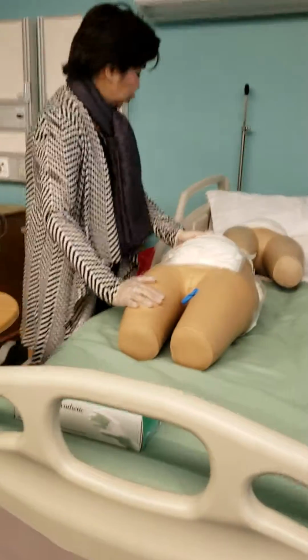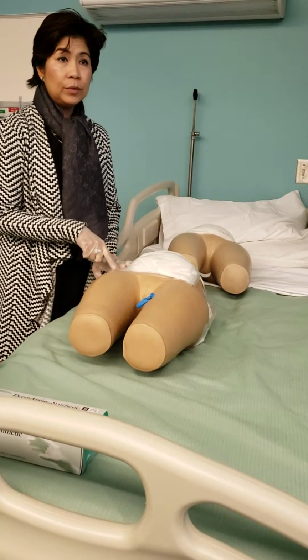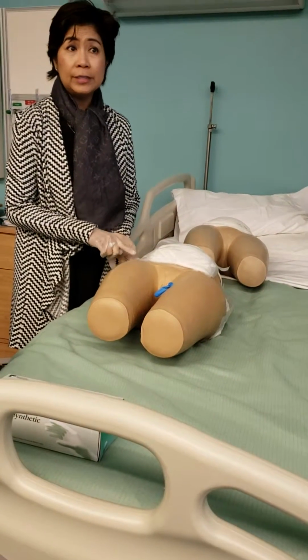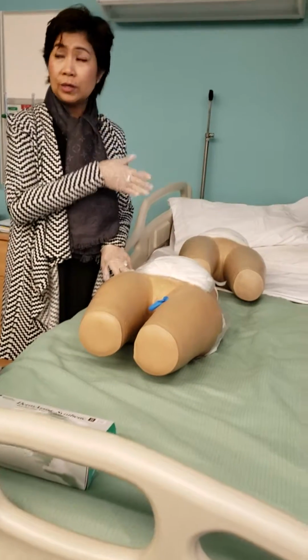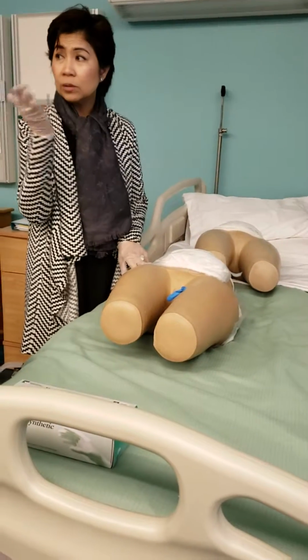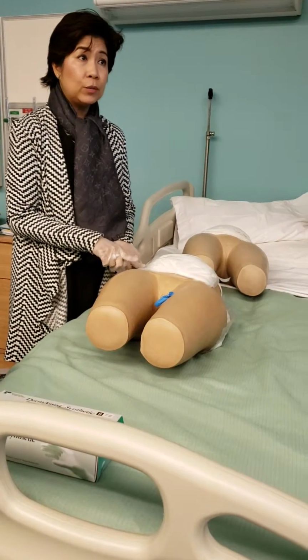All right. Usually I have some sort of tape here with the initial of the nurse who did the dressing before. The initial, date, and time. So I know, okay, if it's a daily dressing, I know the dressing was made before. If it's a weekly dressing, then I know when to dress the patient, because I just count 7 days after. So it will tell me when the dressing was last.